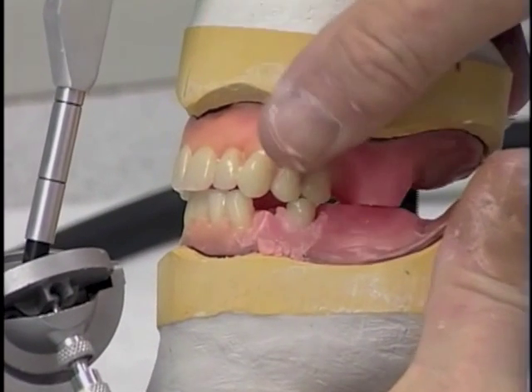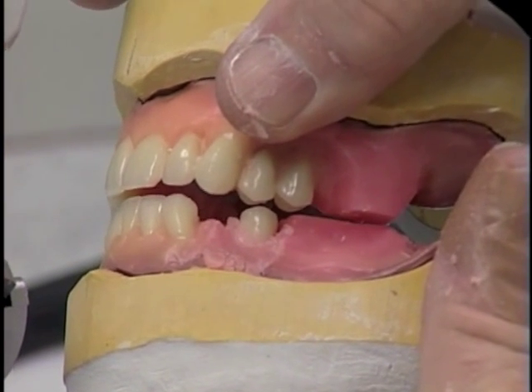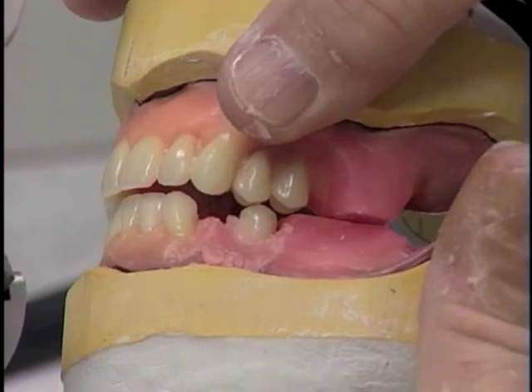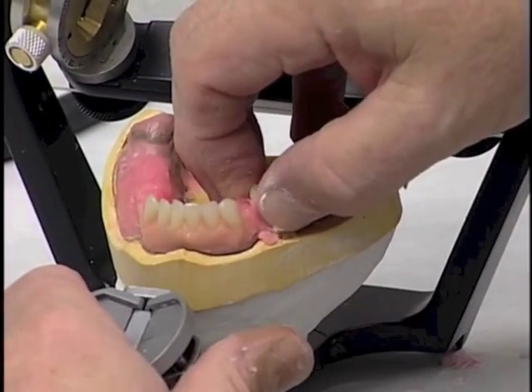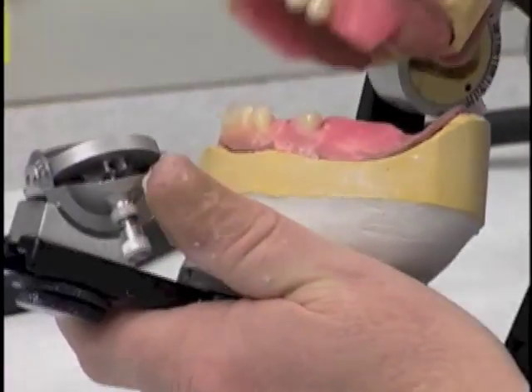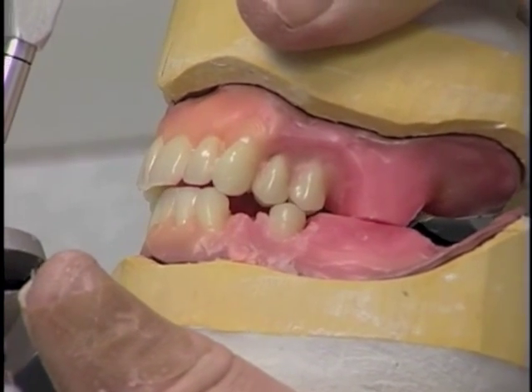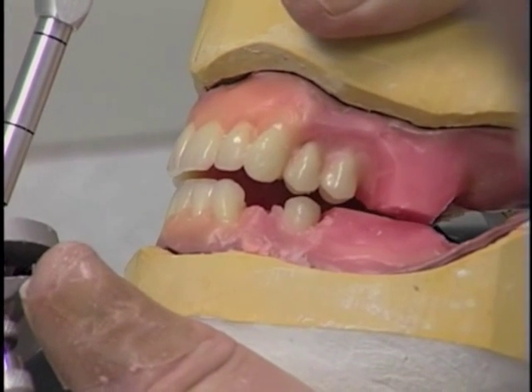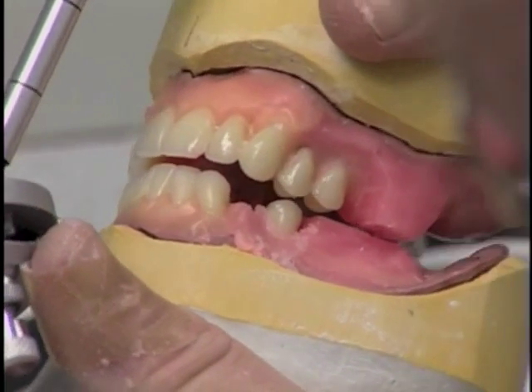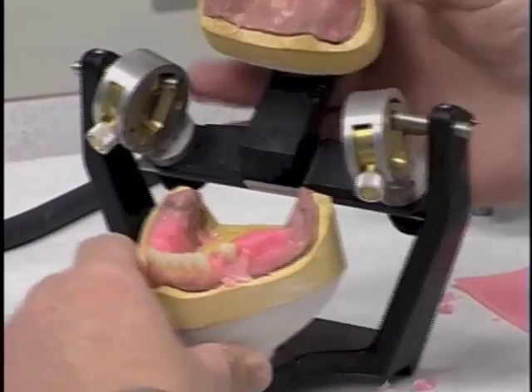If we bring it into balancing or non-working relation, we should begin to get some contacts there, and that's what we're not getting at this point. We're slightly off. Okay, so we need to play with this tooth just a little more, raising it up just a bit, and see if when we place it in centric relation, it works fine. In working relation, it's working fine. And we're closer in our lateral relation, but it's still missing by 1/2 millimeter. It means that that tooth is probably a little bit too far to the buccal.